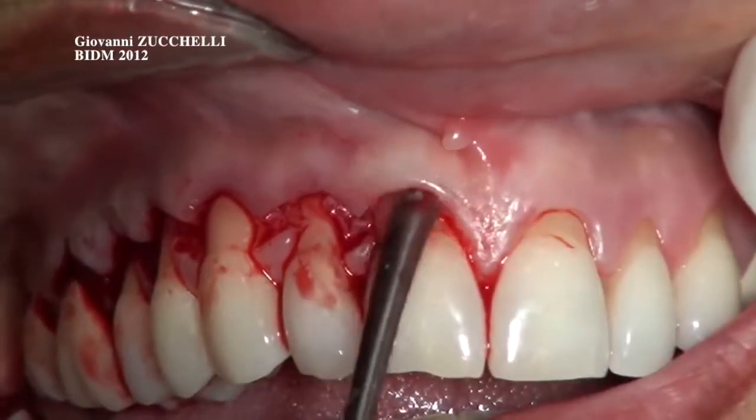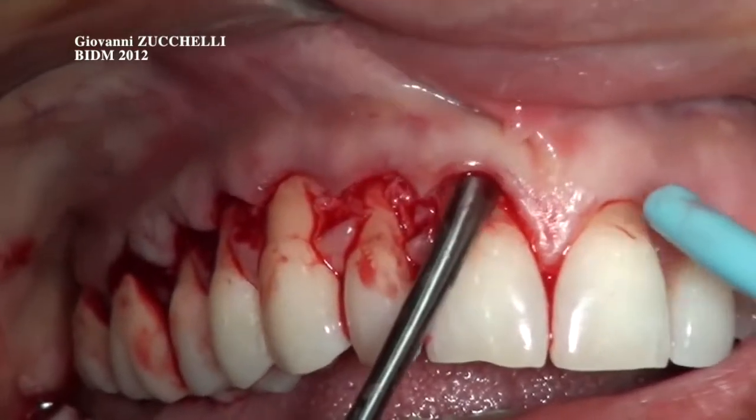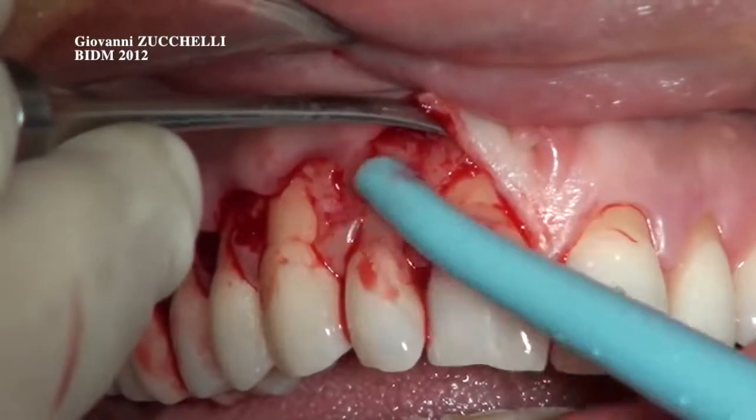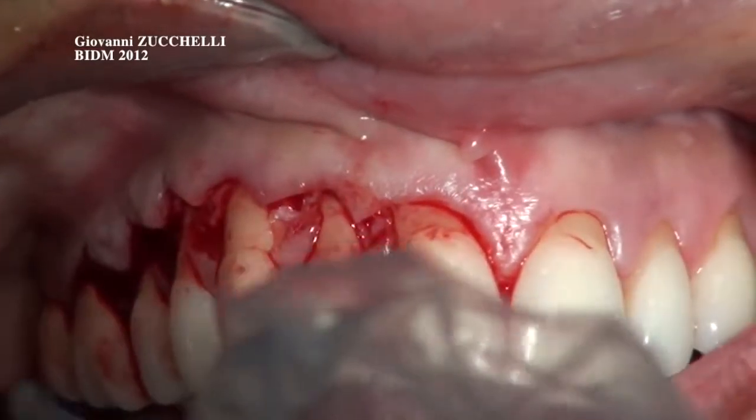Okay, full thickness flap elevation of the keratinized tissue apical to the central incisor. You must see the bone crest here, you can see it. And now the blade, may I have the blade, please?